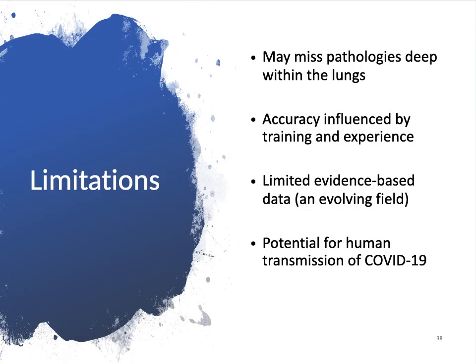At the end, it's very essential and important to know our limitations, because lung ultrasound may miss pathologies deep within the lungs, which is one of the limitations of this tool. And in this aspect, CT chest, of course, is better. And I would stress on that CT chest is still the gold standard imaging modality for patients with respiratory conditions.